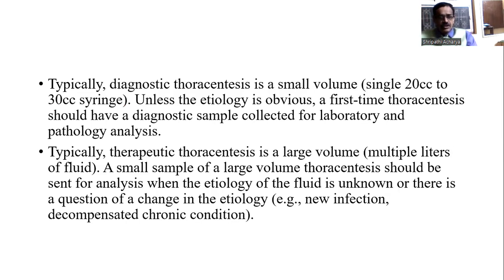Typically, diagnostic thoracentesis is small volume, 20 to 30 milliliters. Unless the etiology is obvious, the first thoracentesis should have a diagnostic sample collected for laboratory and pathology analysis.